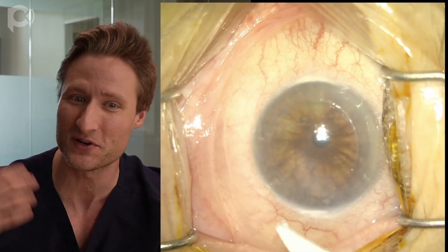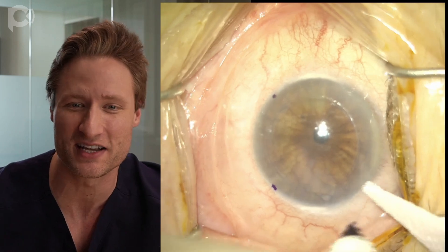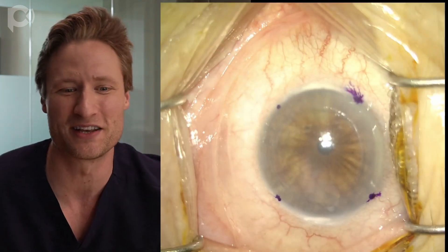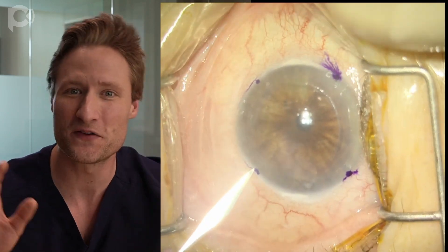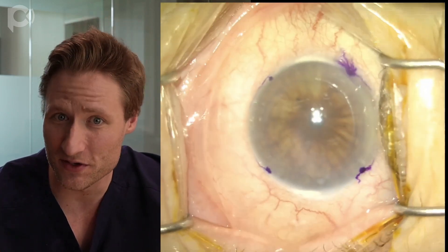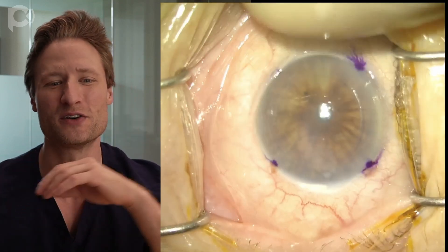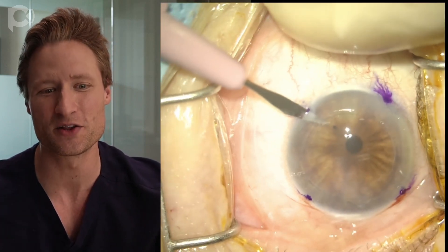For anesthesia, you can use topical, subtenons, or retrobulbar — we used retrobulbar here, so this eye has great anesthesia and akinesia, and the eye is even propped up a little bit, elevated, which makes it easy to access. The first thing I did was dry the epithelial surface with a Weck-cel sponge, then used an 8-millimeter trephine to make an epithelial impression on the surface of the cornea, so I know where to center the graft.